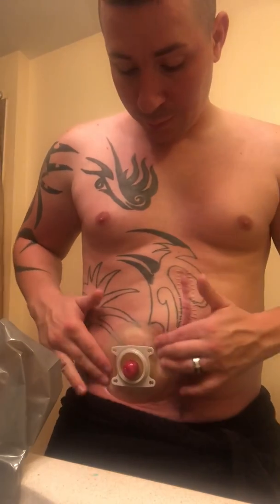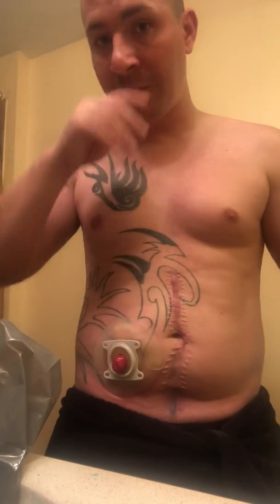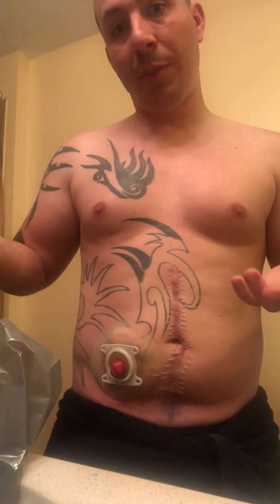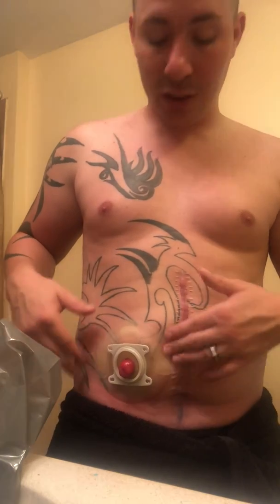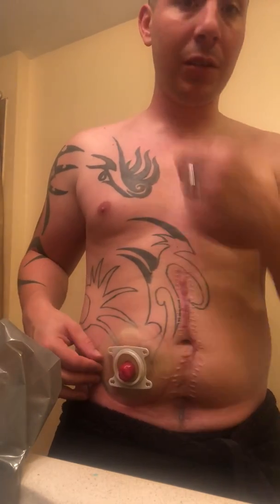And there we go. This seal will last me anywhere from 4 days to up to 7 to 8 days if I forget what day I change on. And I don't have any issues with leaks unless I get to that extended time, and then the glue just starts to deteriorate.